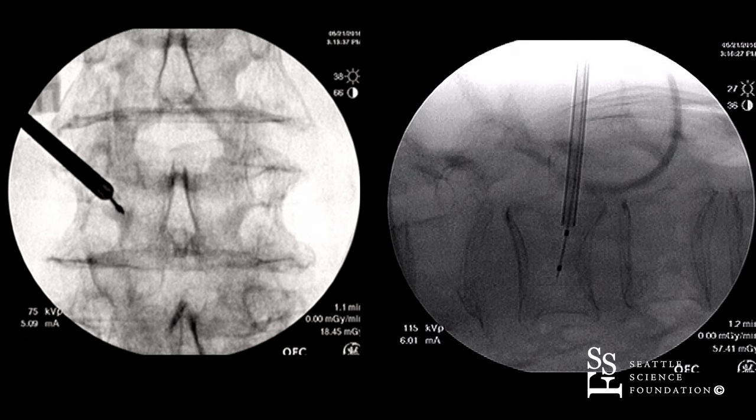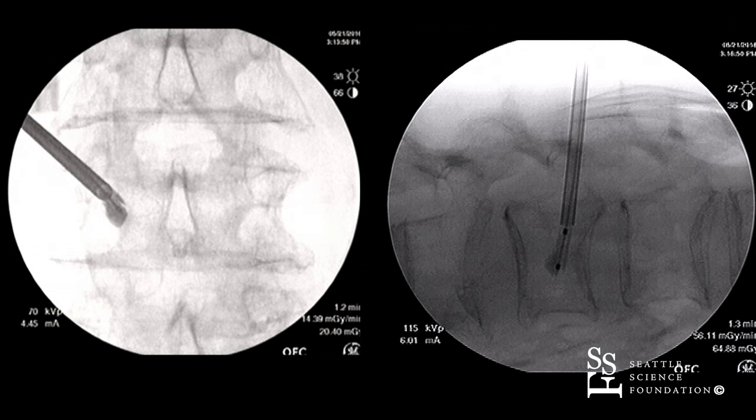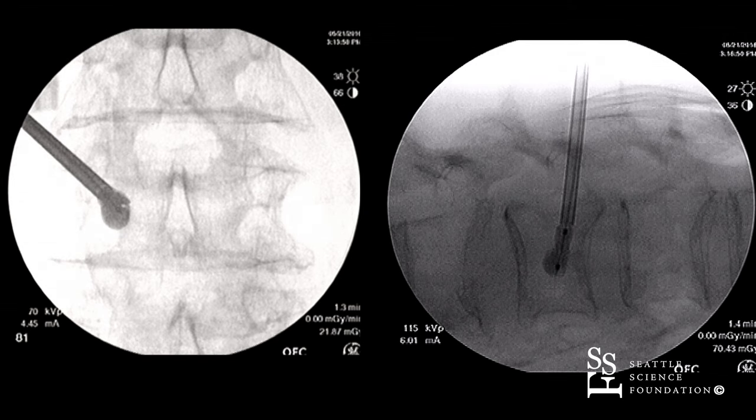In this instance, we probably need to access the vertebral body on both sides, but we'll just do the one side. We're inflating the balloon right now, slowly watching and making sure that we're staying away from the cortical walls while keeping an eye on the pressure.